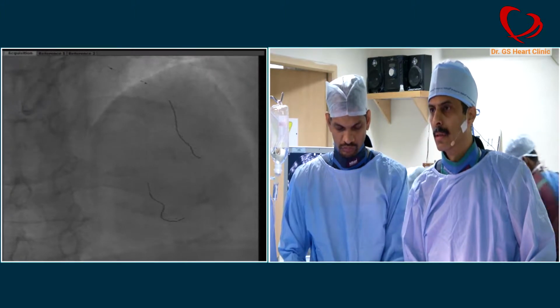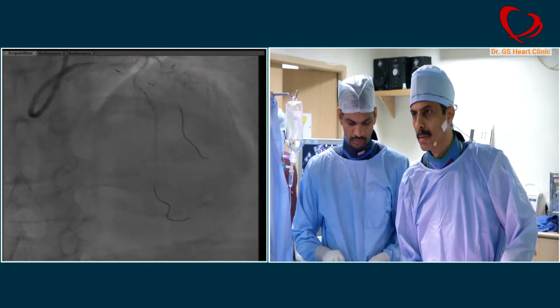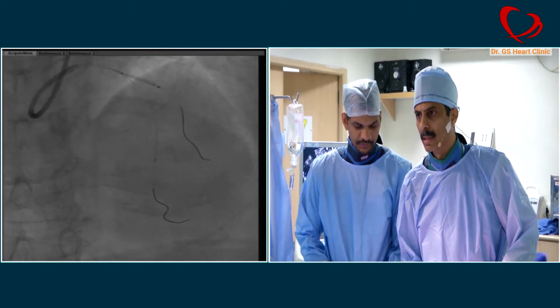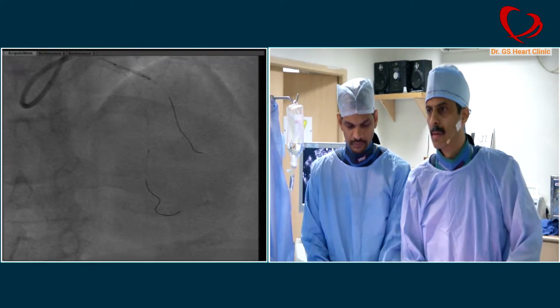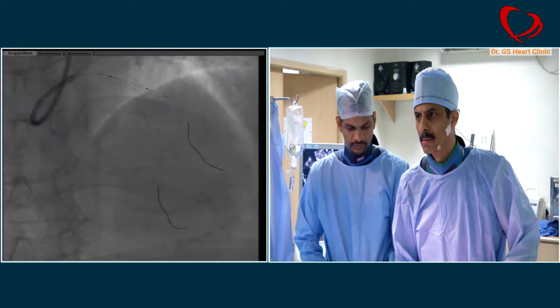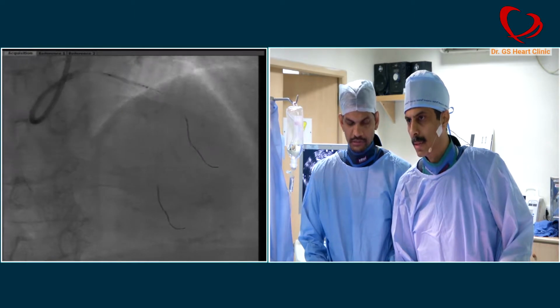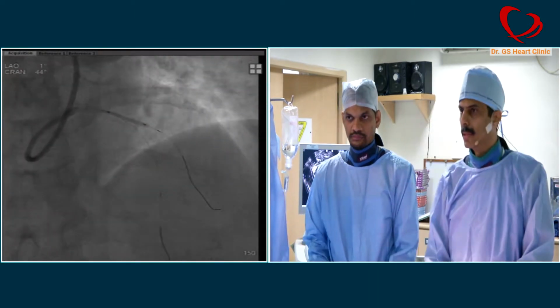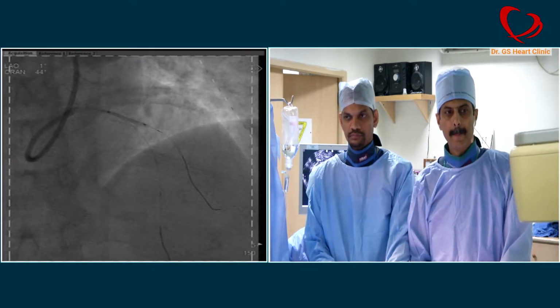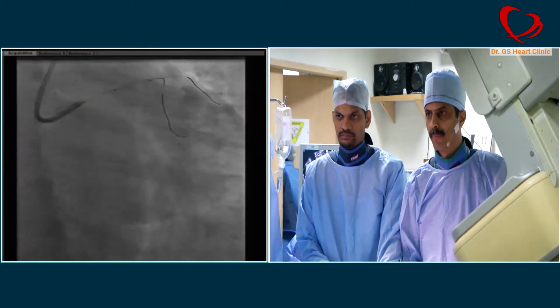Okay. Give me a small test. We may not get any flow. Let's see. Okay, go up. Negative. Yeah. Go up. 4, 6, 8, 10. Okay, come to caudal, please. Negative. Small test.